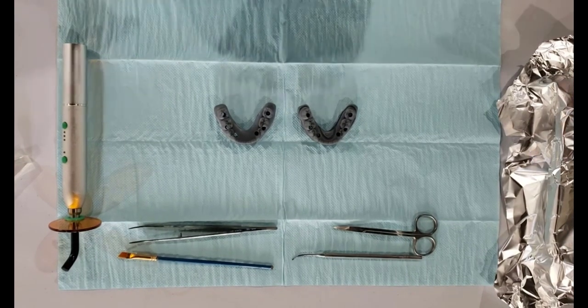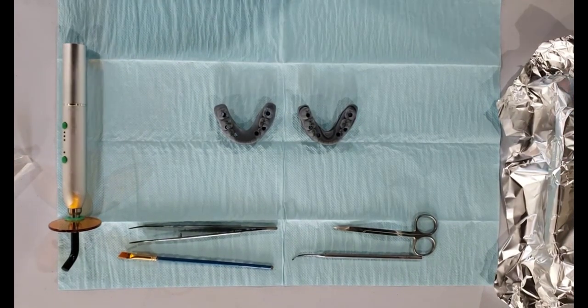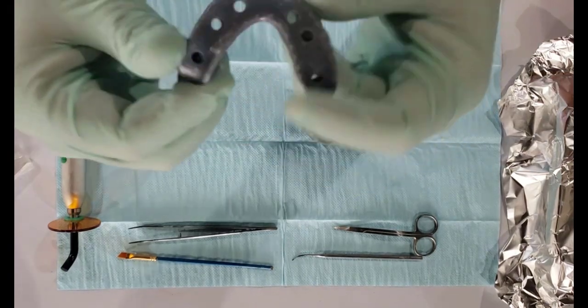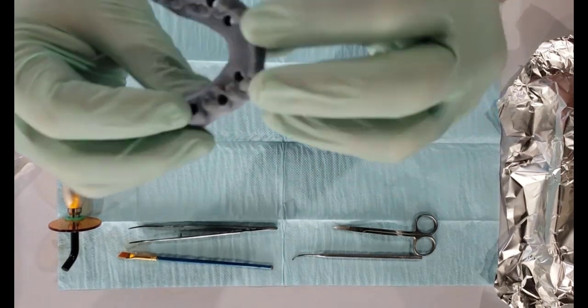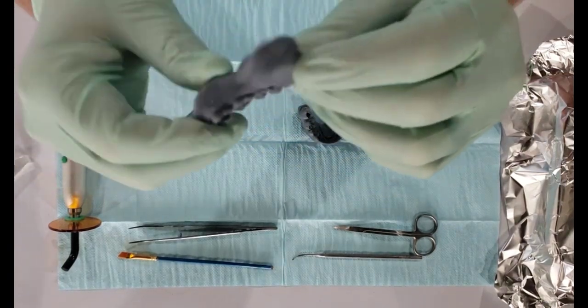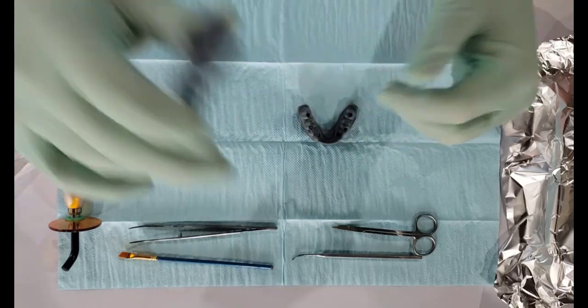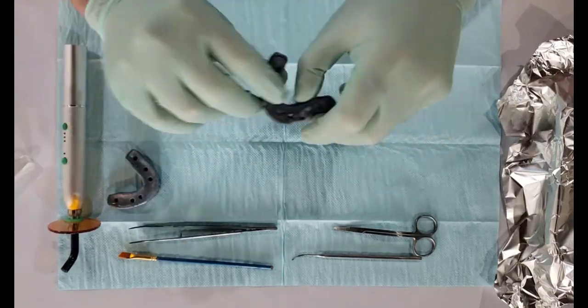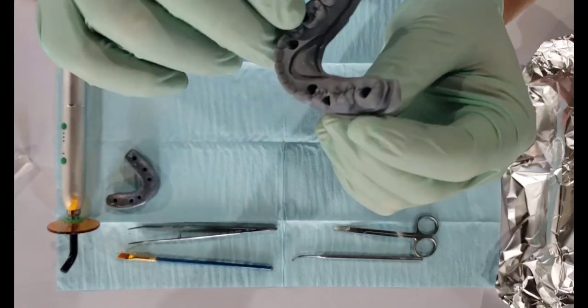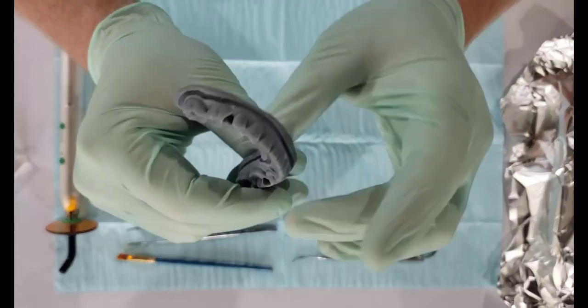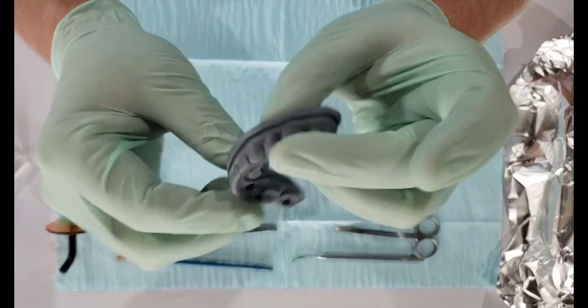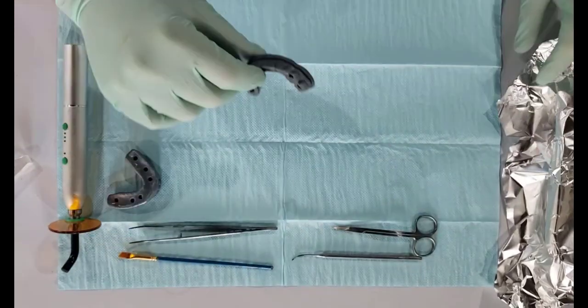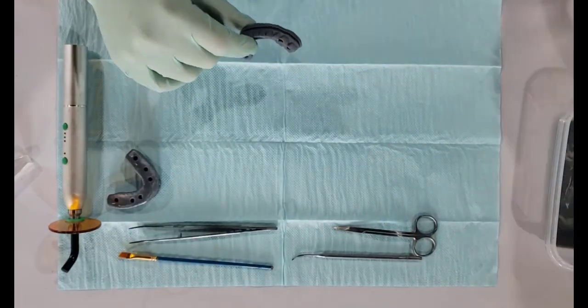Here I have the two printed hybrids. This one has no channels, and we'll do a strength test on that. This one, as you can see, has the channels that I've designed built into it.